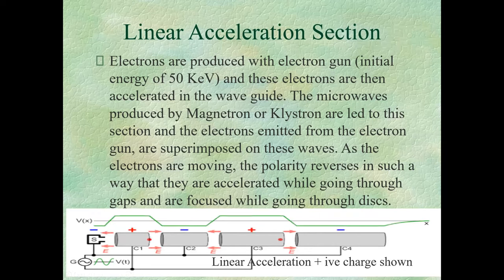So now coming back to the beam delivery in the accelerator head. When the electrons are bent through 270 degrees, or in some cases 90 degrees, they hit the target. So first, we encounter the target in the electron path. For those of you who are preparing for exams, please pay special attention to this section because there are questions regarding it.